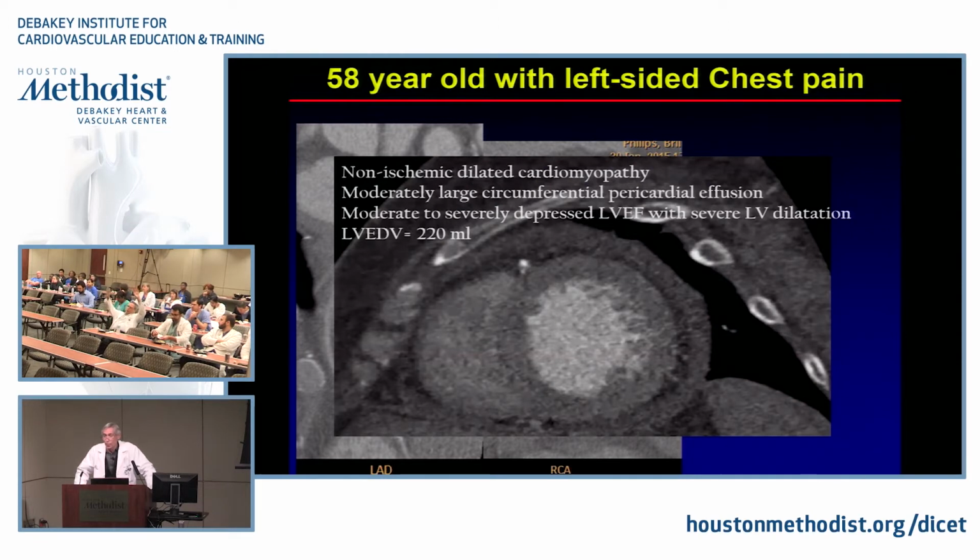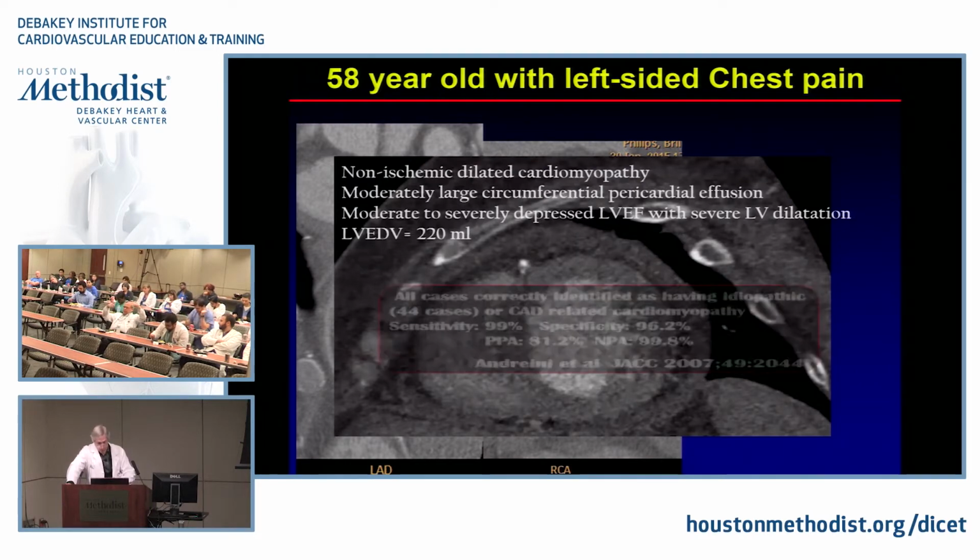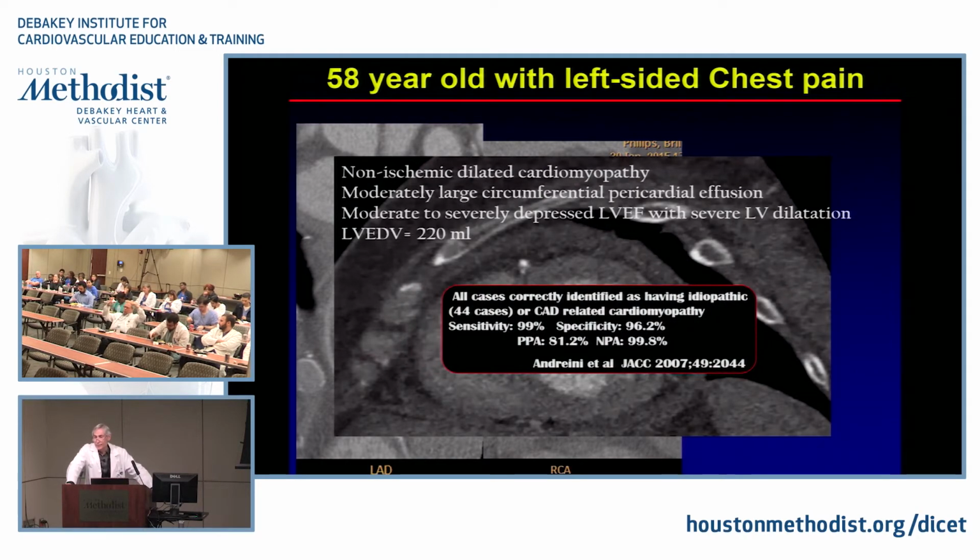John, this is a great case to generate a discussion. Yes, that's the whole point. When you have somebody with a lousy LV, and you try to decide ischemic versus non-ischemic, wouldn't it be more cost effective to just go straight to the CT? Yes, and that's why. If you look at the data, we're doing 2 tests, 2 expenses, and at the end of the day, you still have to do the CT. True, and it's not because we didn't order the study.